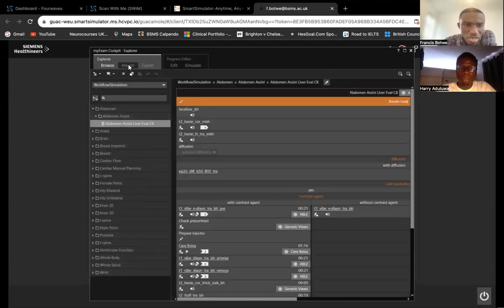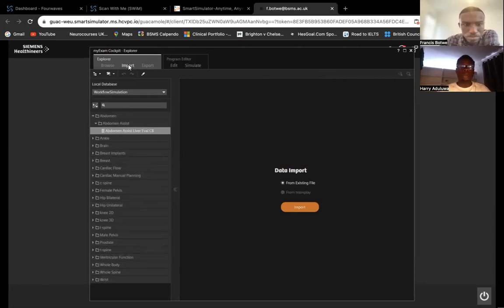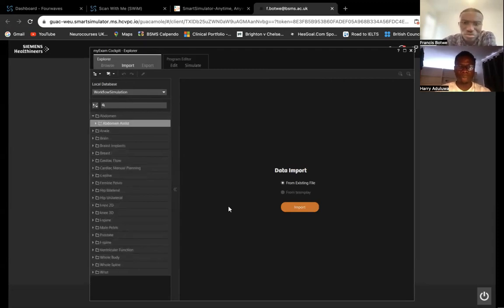Okay. I think with that little knowledge, they should know how to run the cardiac. You have given them enough cue. So you should go to the next point. When it comes to the importation of protocols and the exportation, I don't think the subscription users are going to use that, but I'll still go through that because the protocols that we want you to use, we will upload them on there for you.